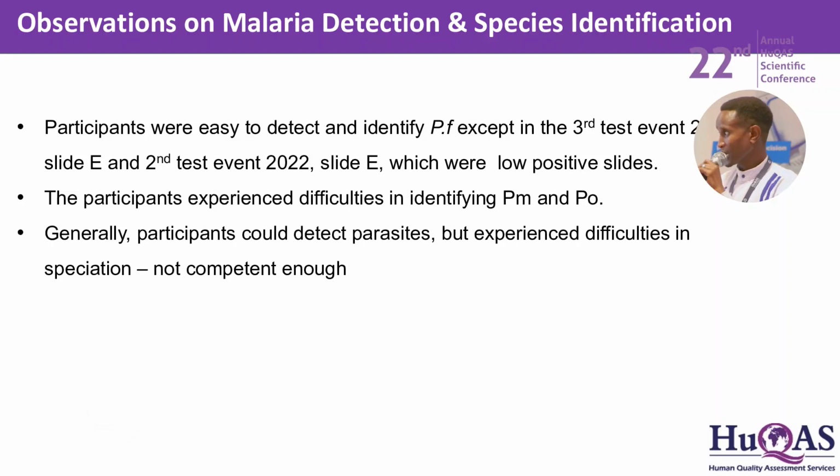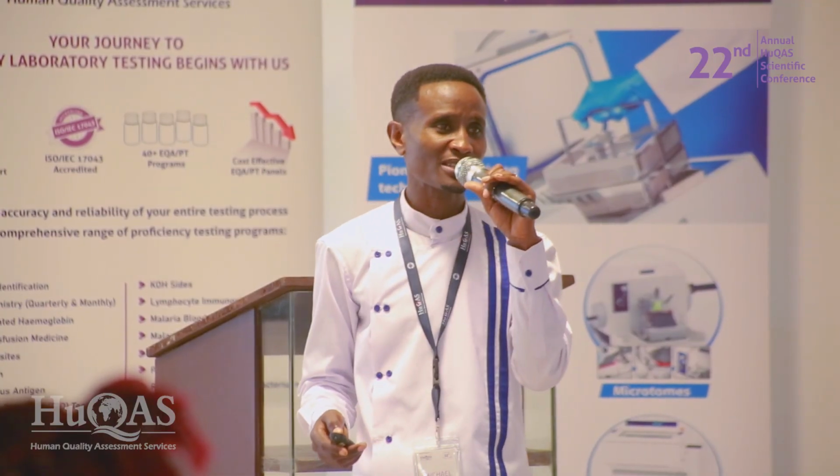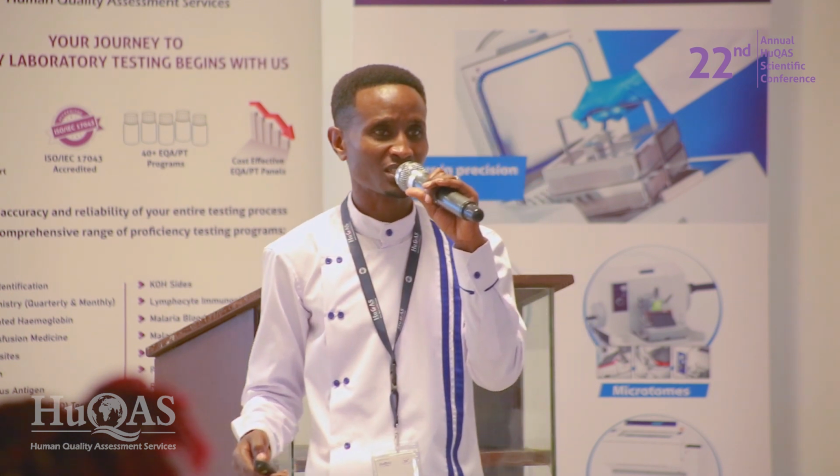So we looked at PF, PM, and PO. We need to see the competency of the participants in species identification. Yes, the patient may go home with the correct medication, but the aspect of speciation is very important in terms of treatment of the patient.